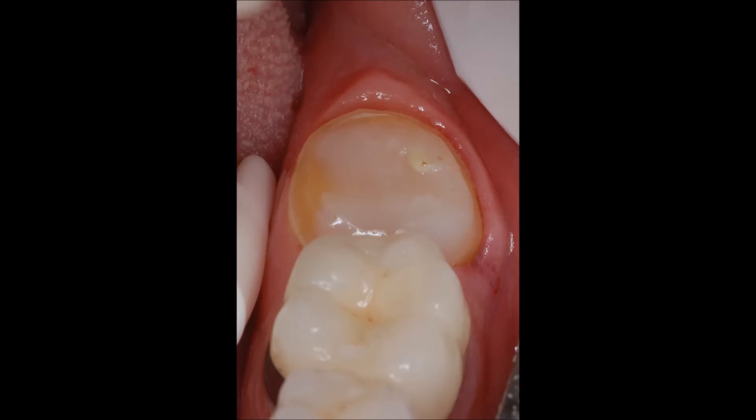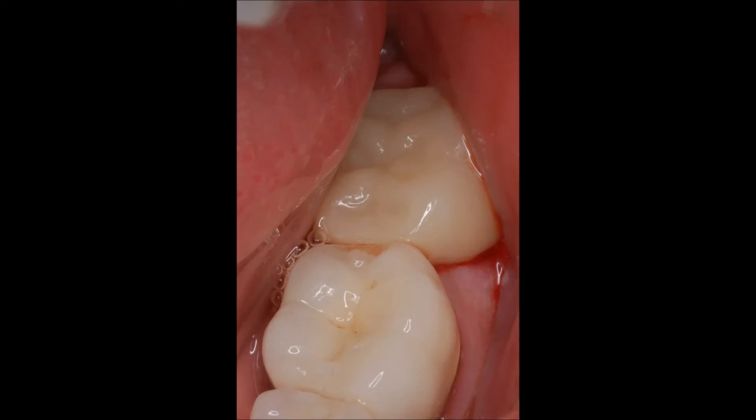The Garmers saliva ejector setup now provides excellent isolation for bonding the Emax crown. Emax crown bonded. The large tongue and plump cheek had to be restrained throughout the procedure — the Garmer saliva ejector setup in combination with the neo-drys made this possible. It worked well for this difficult case. Imagine how well it will work on routine cases.